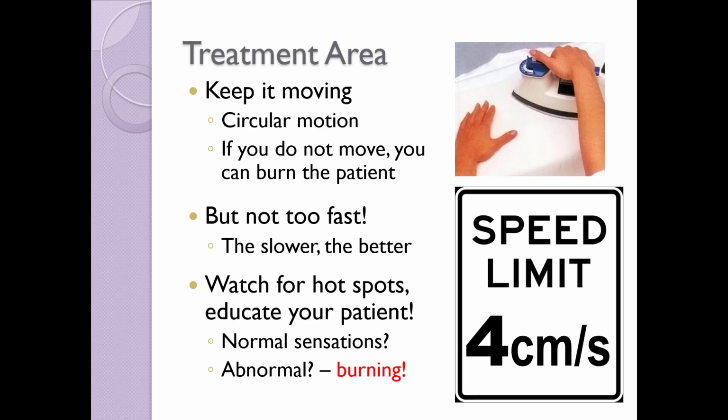We need to watch our patients and their reactions for potential hot spots that can be created by the beam non-uniformity ratio, or the BNR. Prior to treatment, we need to educate our patients that a burning feeling is not a normal sensation. Burning indicates that there is a potential for tissue damage. The patient should feel a slight warming of the tissues if it is a thermal treatment, but it should be comfortable during the entire treatment.